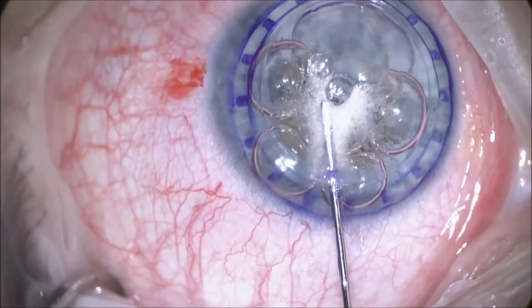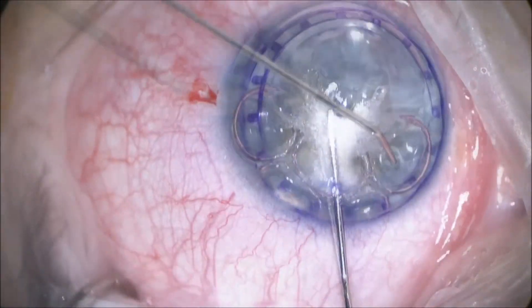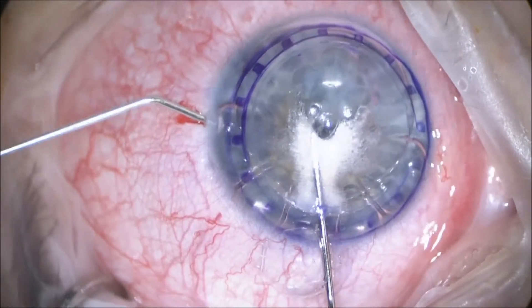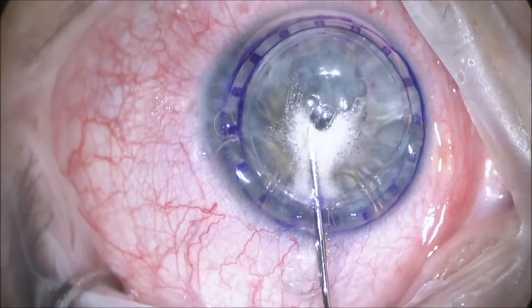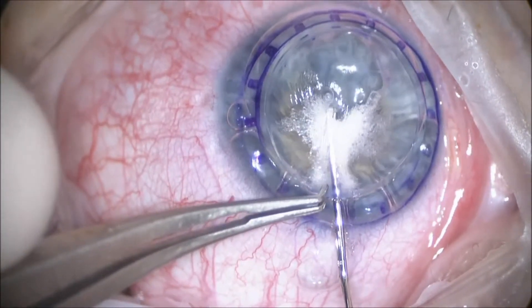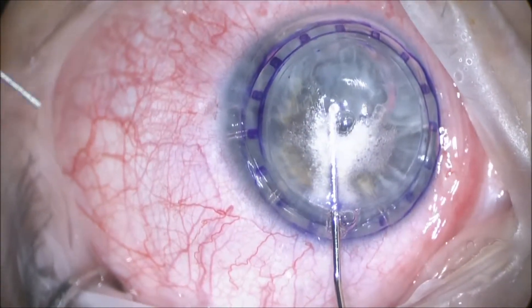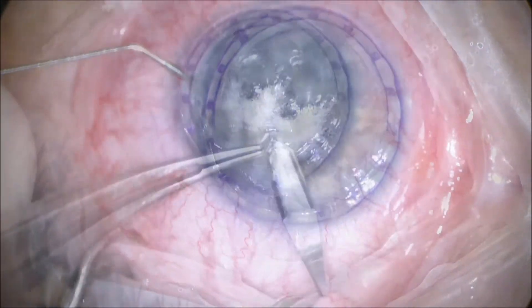We advance the catheter here a little more and inject more air. We see that the bubble gets larger and larger and the anterior chamber air bubbles are pushed to the side. At the bottom portion of the picture, you see that the Descemet's detachment hasn't fully separated, so we inject a little more air, and notice that it is completely within our trephinated mark.